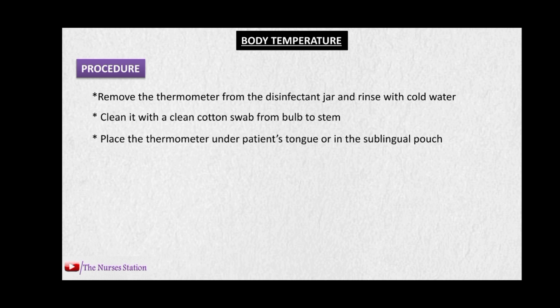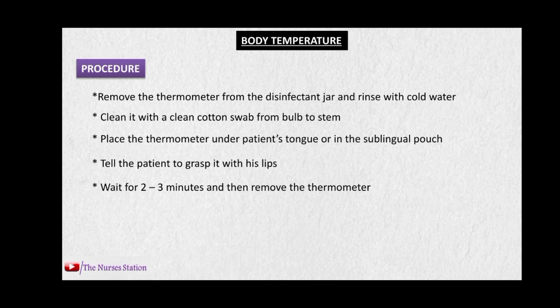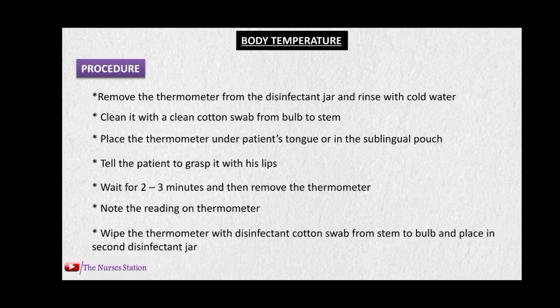Place the thermometer under the patient's tongue in the sublingual pouch. Tell the patient to grasp it with lips and not to bite it with teeth. Wait at least two to three minutes for the thermometer to record the temperature, then remove it and note the reading. Wipe the thermometer with a disinfectant swab from stem to bulb — after the procedure the bulb is most contaminated — then place it in the second disinfectant jar.